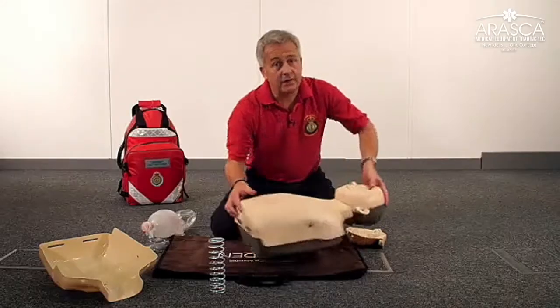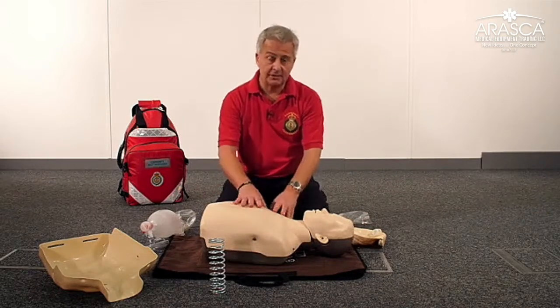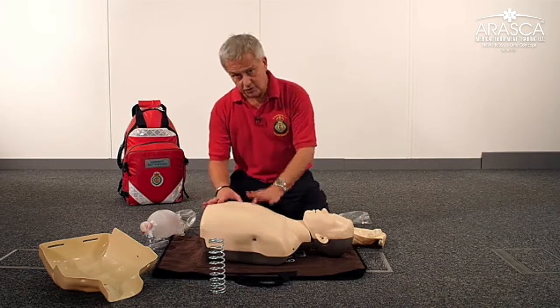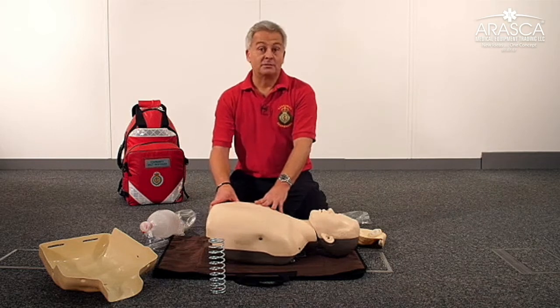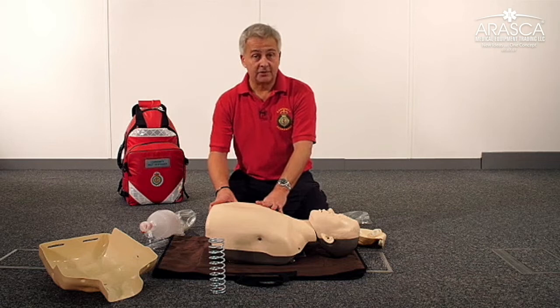So this is the Brayden Junior Conversion Kit. It allows you to convert the adult Brayden into a junior mannequin whilst your students are having a cup of tea or a short break. Thank you very much.